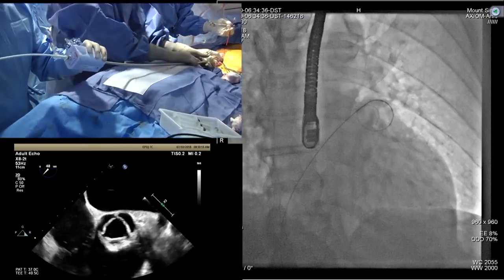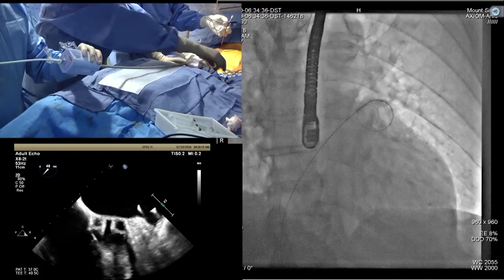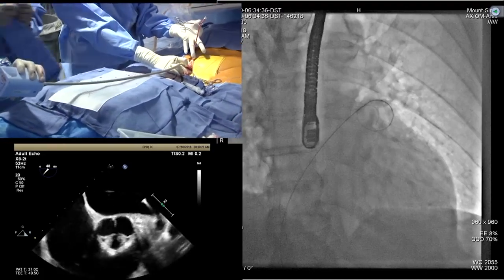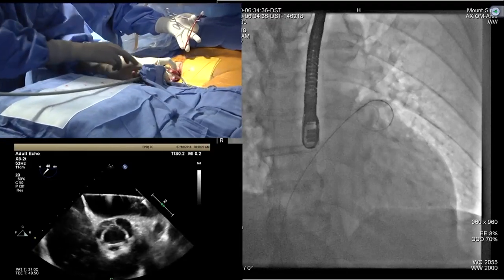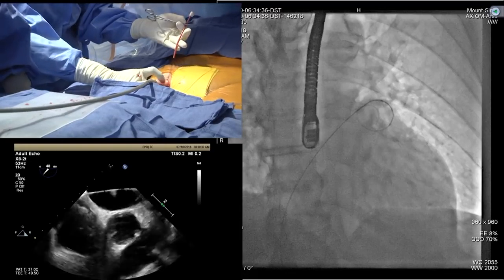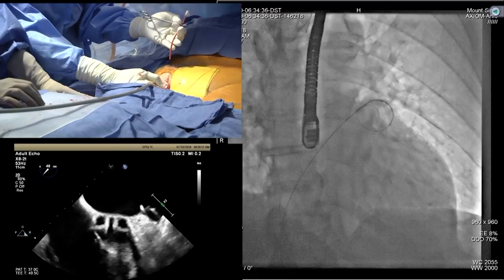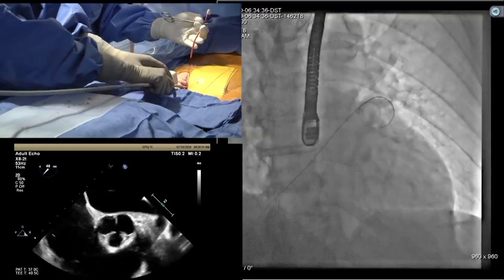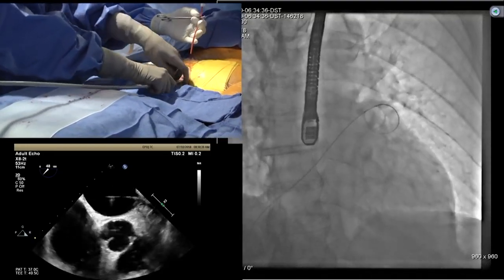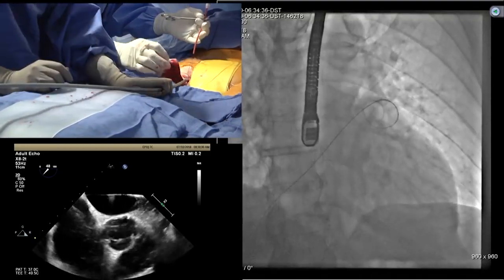Can we zoom in at the insertion? So you can see the advantage of using a figure-eight or mattress suture here is that I don't need to put my hand on the groin. You keep the entire view in place and you just pull this up to be able to tamponade the area and hold pressure. Yes. So same thing, one person is holding the wire. Give me the dry gauze. Now it is too slippery.